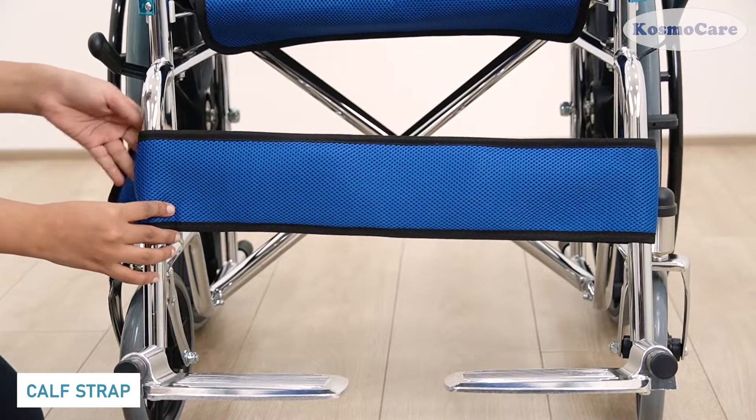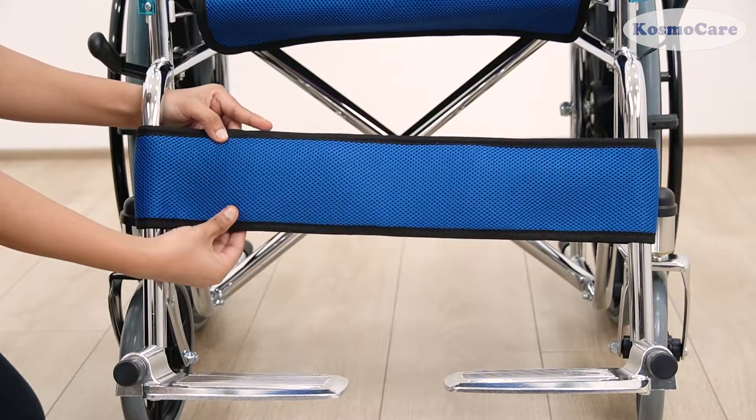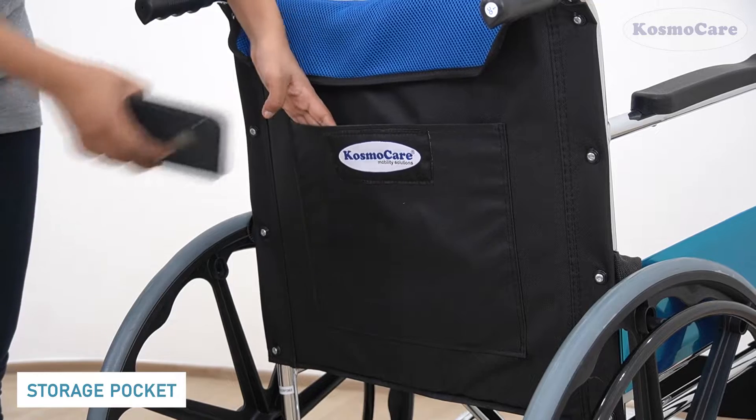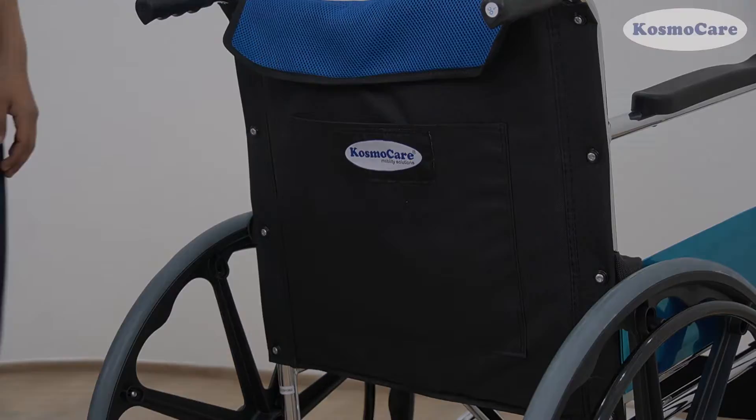The footrest comes equipped with a detachable calf strap to support the legs. Waterproof PU arm pads are extremely durable. Store your essentials in the back storage pocket provided while keeping your hands free.